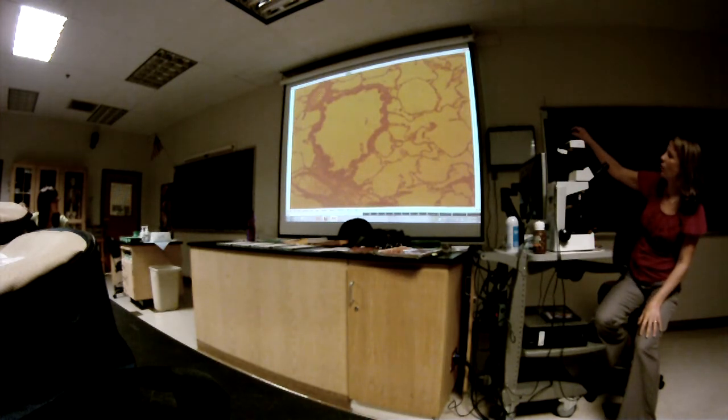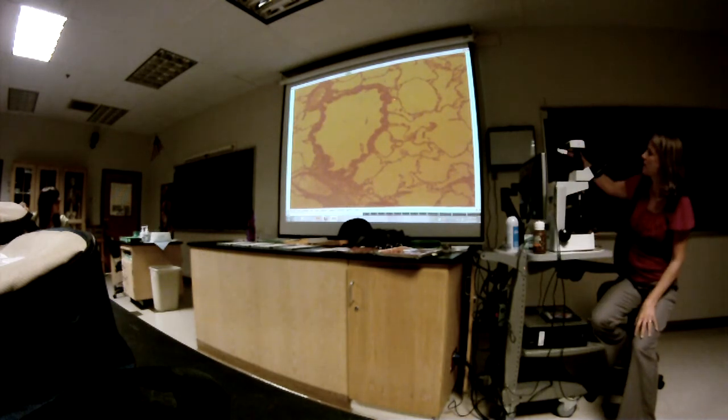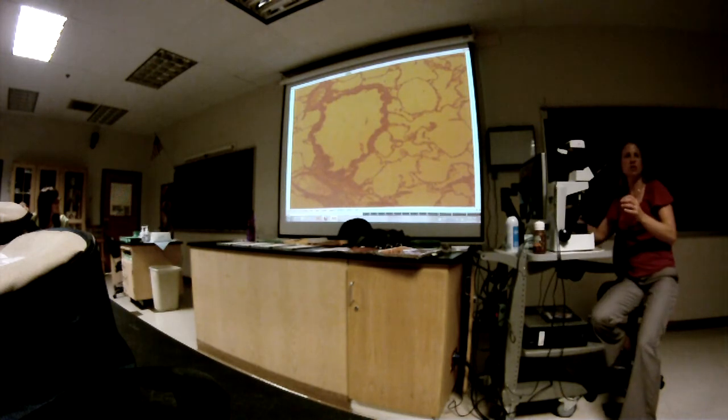Usually they look kind of wavy like that, but the smooth muscle is not super visible. I see some of it up there, but I'll show you a good example next time.